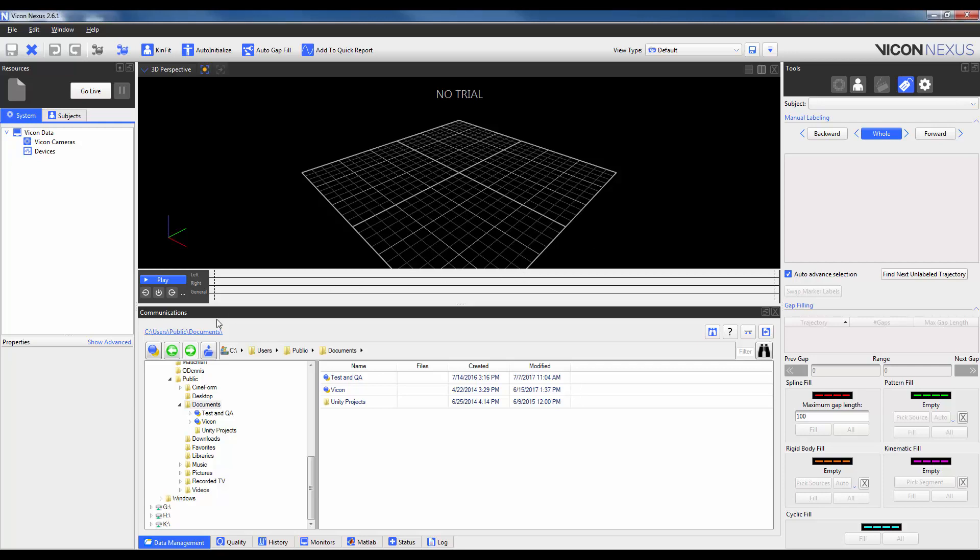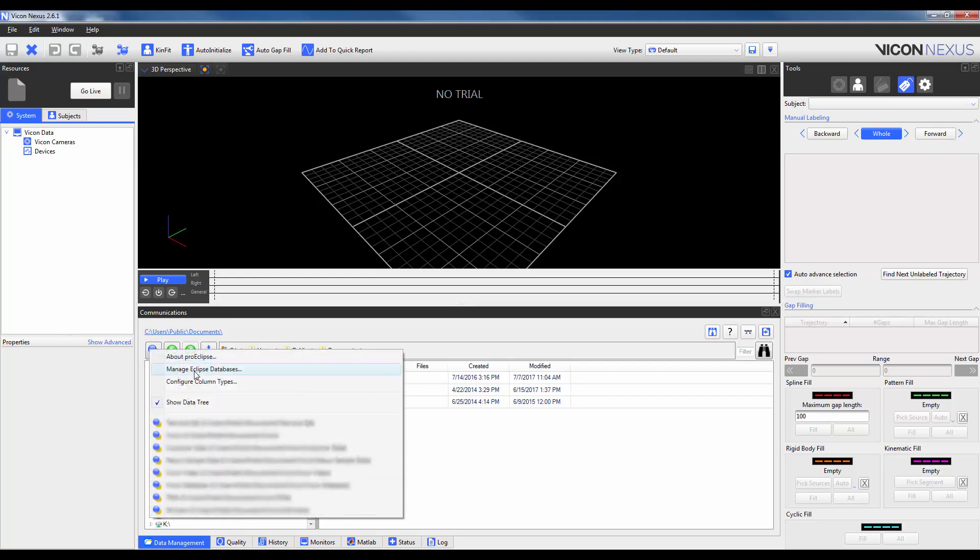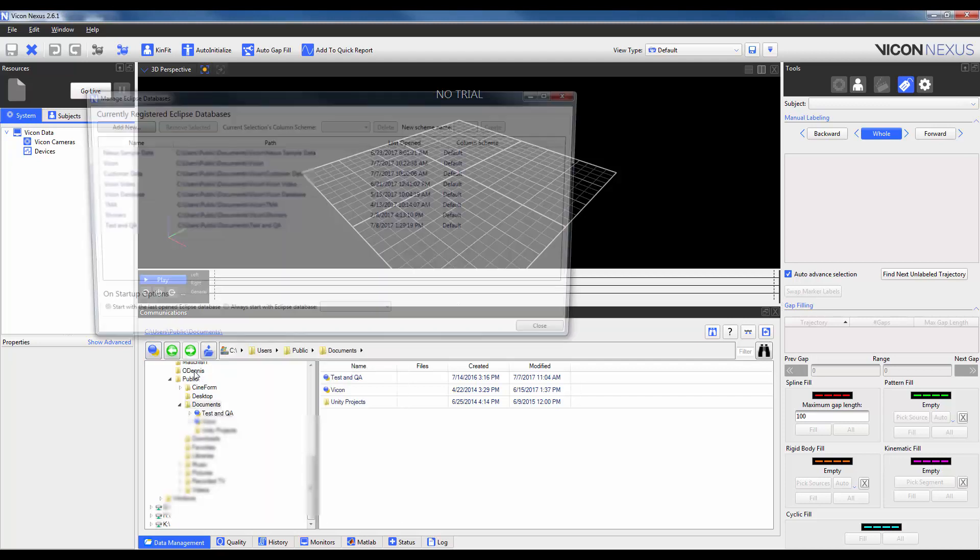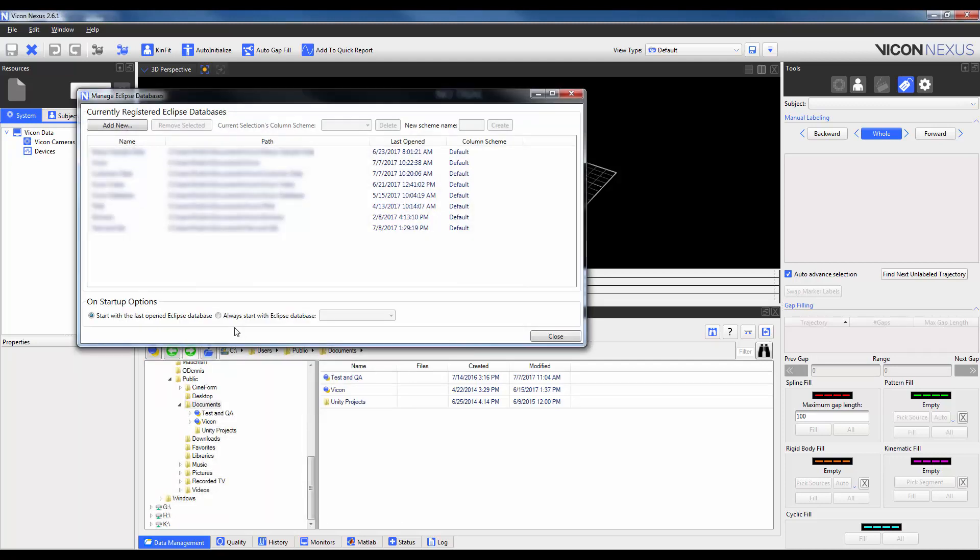To create a new database, click on the ProEclipse menu and select Manage Eclipse Databases. I will explain the layout of this interface later and thus will only focus on creating a new database at this time.